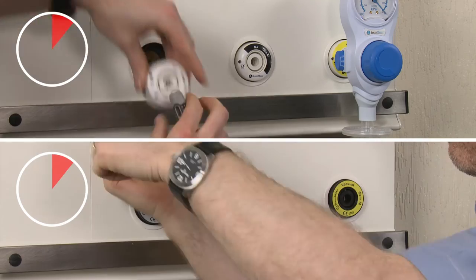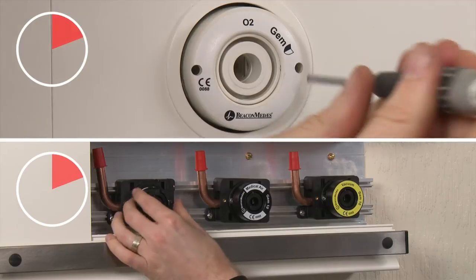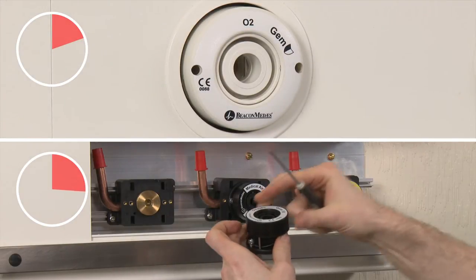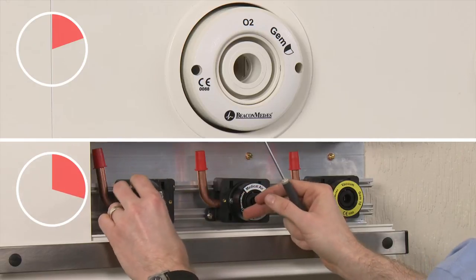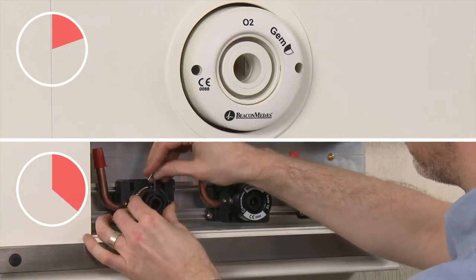As you can see, we have significantly reduced the time of maintenance and to install the outlet. This has been achieved by allowing the fixing screws to be accessed from the front of the outlet, with no need to dismantle the outlet or the bed head trunking in order to install the outlet onto the first fix assembly.